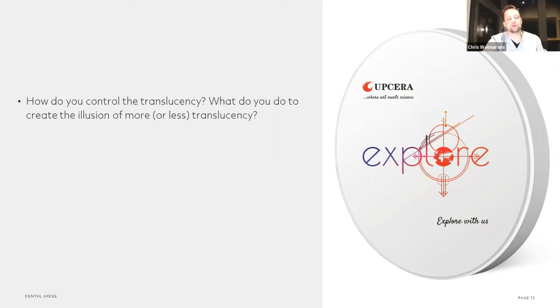Yes, so I think a good way to get those higher translucency simulations is to use dashes or violet. I found violet in the right place in the right amount does uplift the look of the zirconia, and if used in combination with the post-stain and glazing, you can bring out an effect that looks really natural, and sometimes it's hard to tell if it's actually layered or stained. We see a lot of patients where we do final color checking, and the amount of times we can get away with a stain and glaze option, for instance matching a central, which is quite challenging, is probably 70% of the time. You can mimic it realistically and quite accurately.